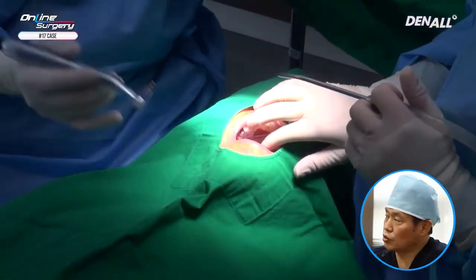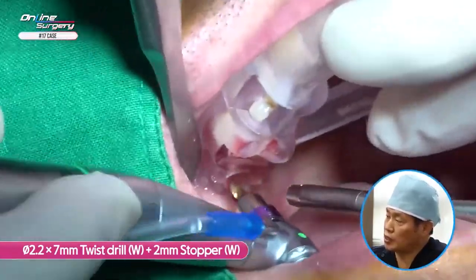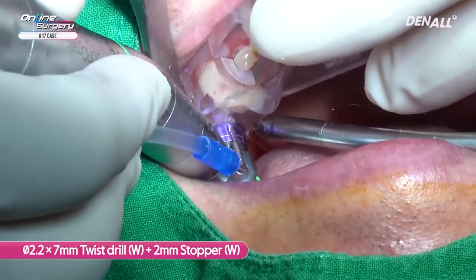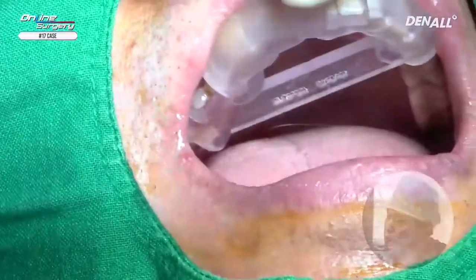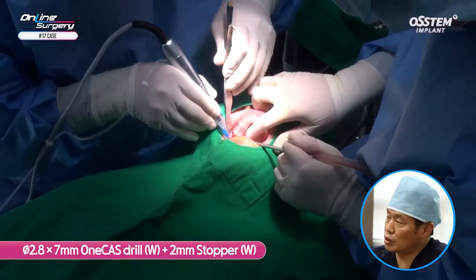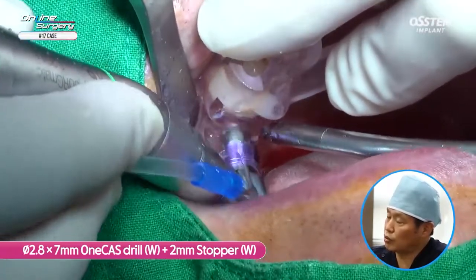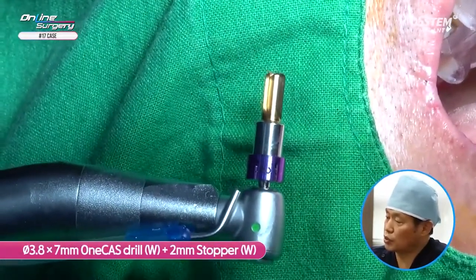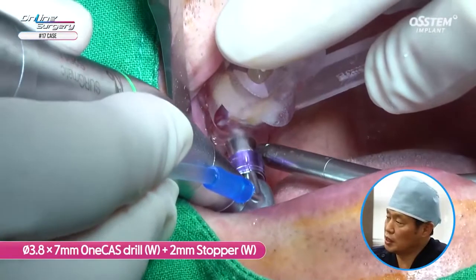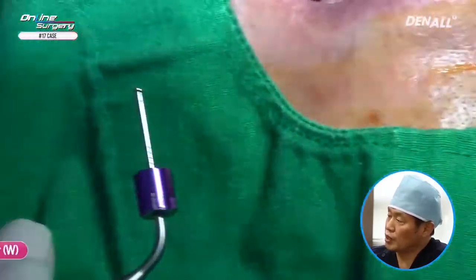The One Guide template is positioned. The residual alveolar bone is approximately 6 mm and safe distance is 5 mm. A 2.2 x 7 mm twisted drill with 2 mm stopper is used, drilling up to 5 mm. Next, the 1-cast drill 2.8 x 7 mm with 2 mm stopper is used. When using 1-cast, in order to prevent perforation of the Schneiderian membrane, you need to widen the access hole first before using the final drill size. Drilling 5 mm using 1-cast drill 3.8 x 7 mm with 2 mm stopper, gradually increasing the drill hole size.